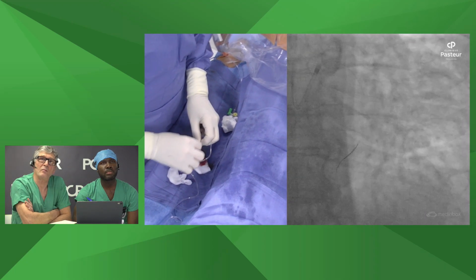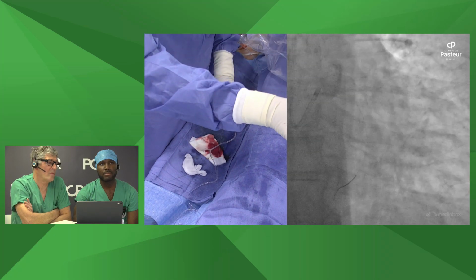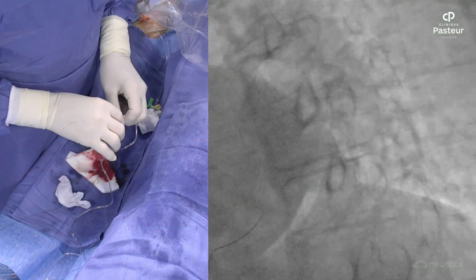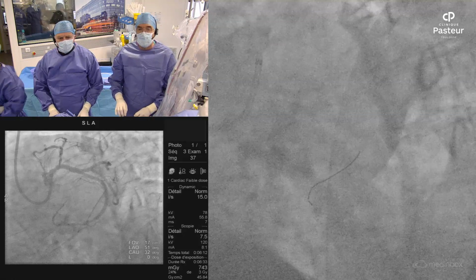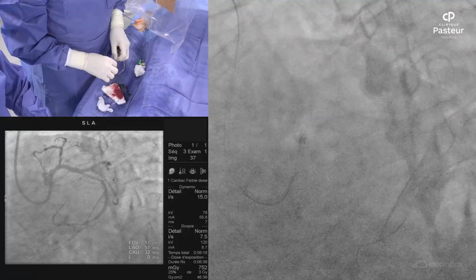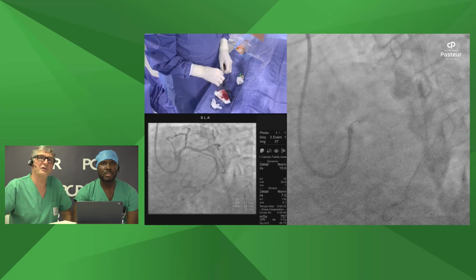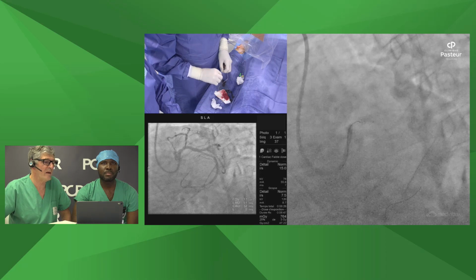Maybe what you can do is take this view. You want to find a view? Yes, 50 LAO by 32 caudal. Okay, so we are arriving here. So Jean, what we will do is ask the audience if they are okay with the plan. We can ask them to vote.